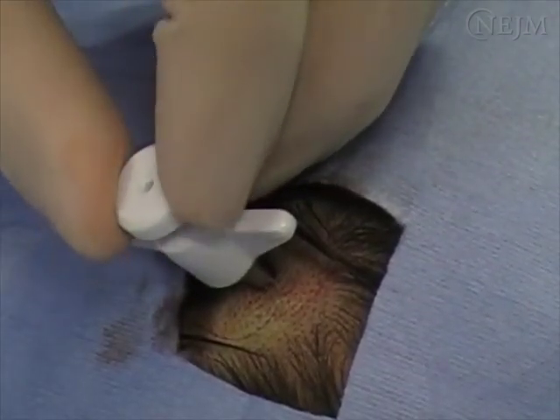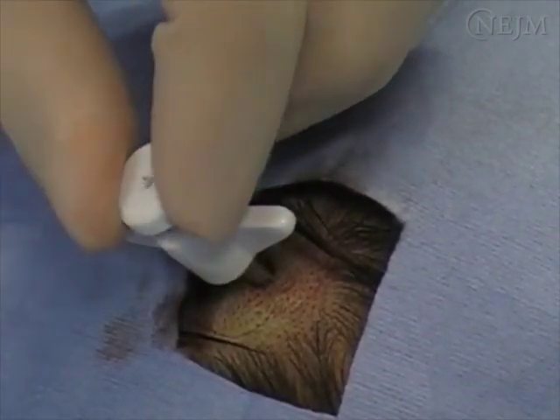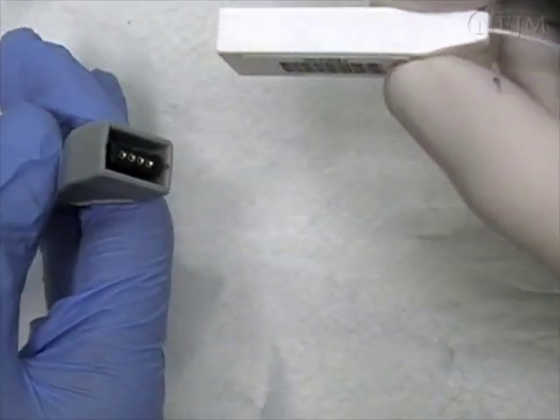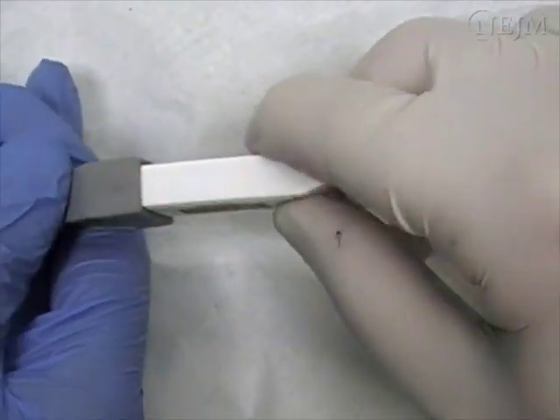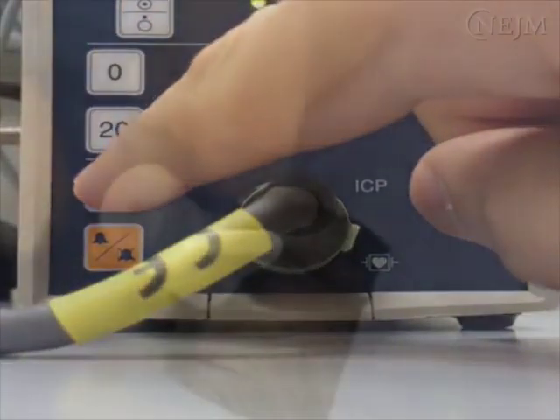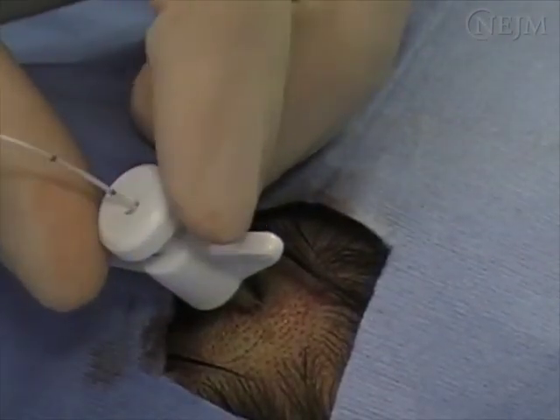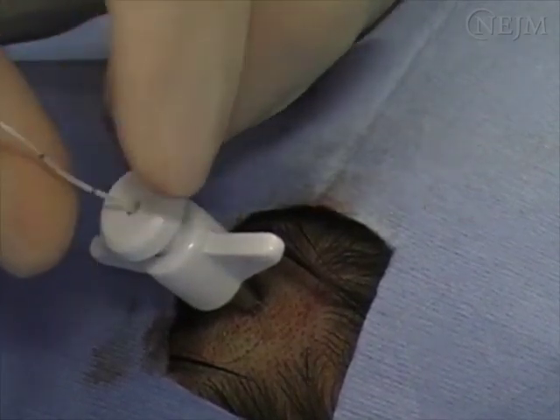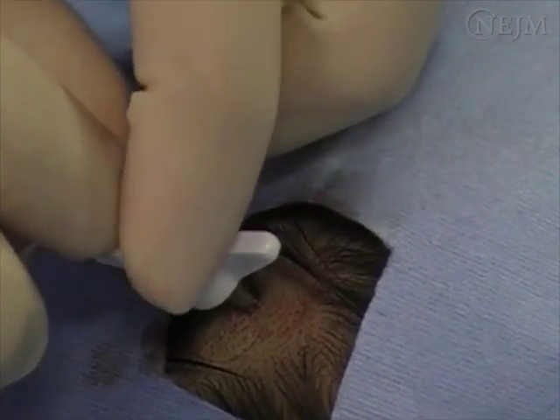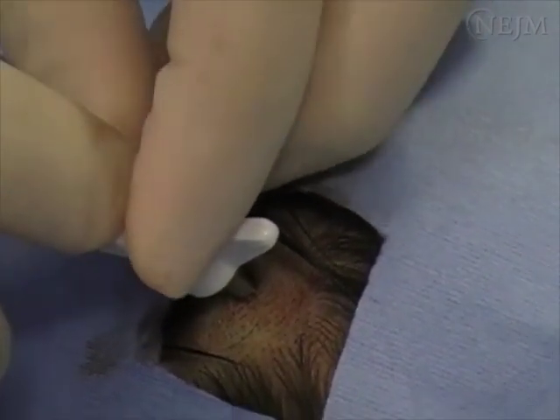Cerebrospinal fluid may be visible at this point. Switch on the ICP transducer. Place the ICP sensor in sterile water and ask an assistant to connect the sensor to the transducer. Ask the assistant to calibrate the transducer and record the reference number. Insert the ICP sensor through the bolt to the desired depth, which is often approximately 15mm into the cranium, and then secure the sensor in the bolt by turning the adapter clockwise.